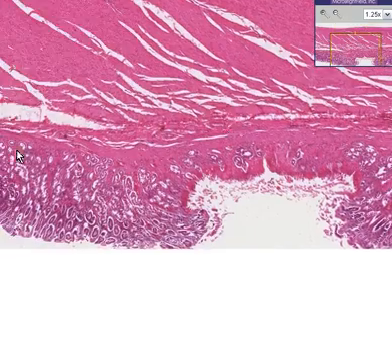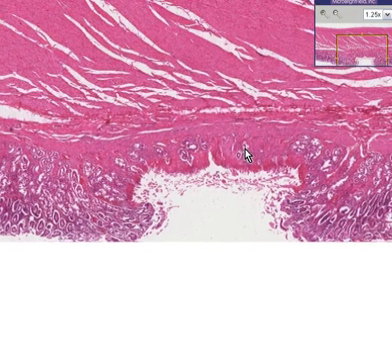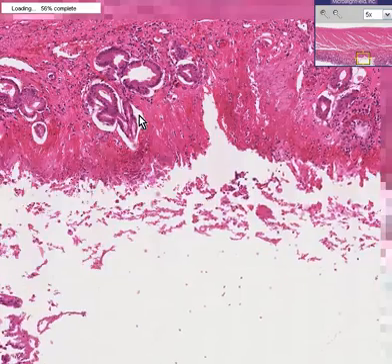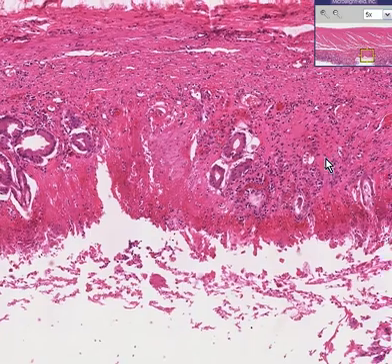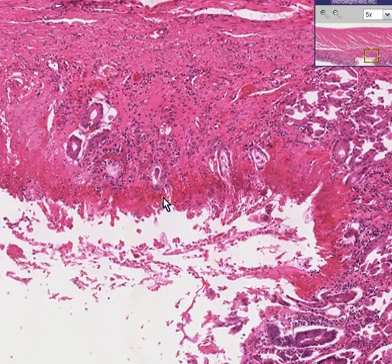But you can see that in the gastric mucosa, in which you have the gastric pits leading into the mucosal glands, there's an area that is thinned out and eroded. And for all practical purposes, you could probably use the word erosion interchangeably with ulceration, although there may be a subtle difference that nobody cares about because the terms are always used interchangeably.